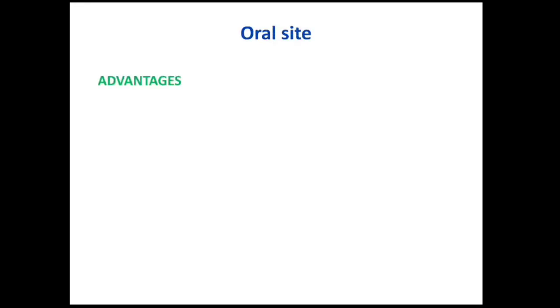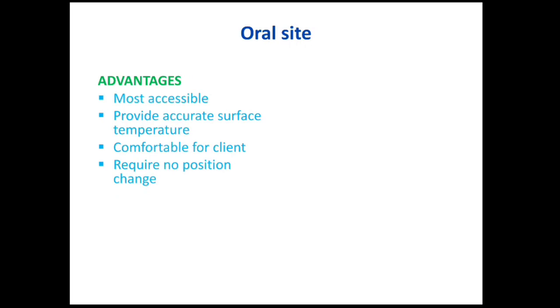What are the advantages of taking the temperature through the oral site? It is most accessible, provides an accurate surface temperature, it is comfortable for the patient and it requires no change in position. So the most accessible site is the oral site.